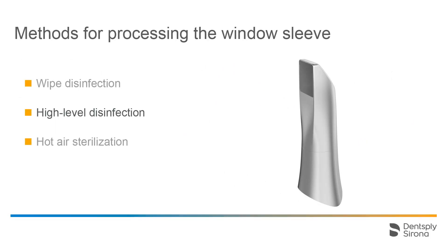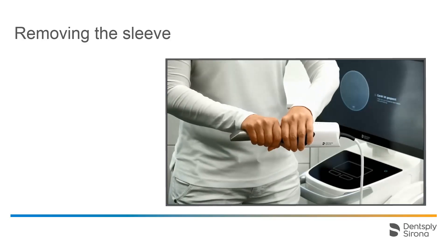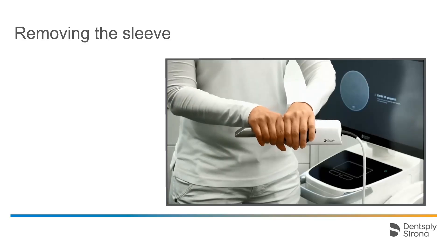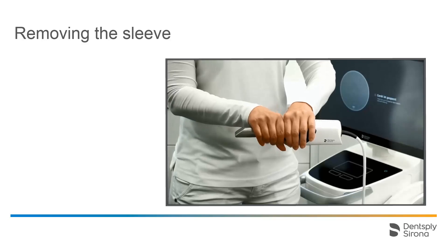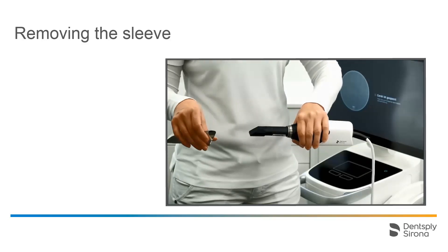Next comes the high-level disinfection procedure of the window sleeve. To do this, the sleeve has to be removed from the scanner. To remove the sleeve, we hold the scanner casing in one hand close to the separation line and the sleeve in the other. Then we create pressure by pushing both hands towards each other so that the sleeve separates from the scanner body. When separating both parts, the sleeve should be pulled off in a straight forward movement without tilting to avoid jamming.